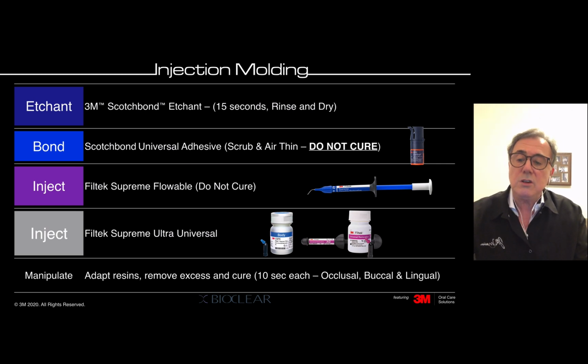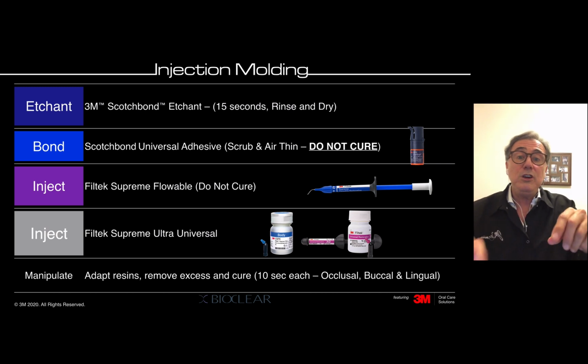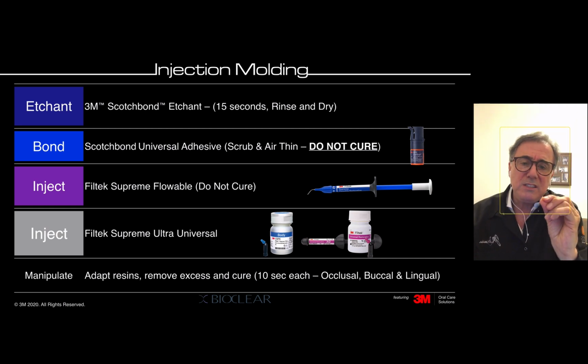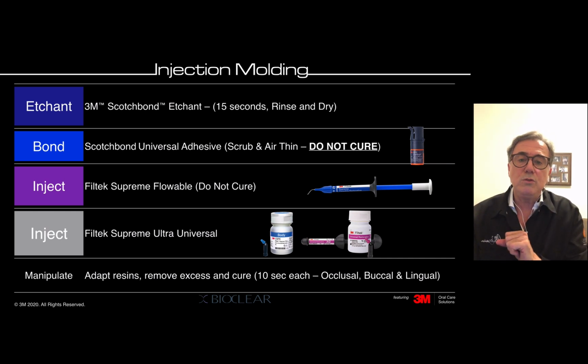Okay, so injection molding, as I mentioned, this is the scheme and how Bioclear and 3M suggest you use it. You etch, you bond. Sometimes a person once asked me if you have to light cure the bond. Here they say do not cure if you have only enamel or just a little bit of dentin. But if you have a large part of dentin in your restoration, after applying the adhesive, you must evaporate the solvent and polymerize. But if it's mainly enamel, you don't need to polymerize the adhesive.